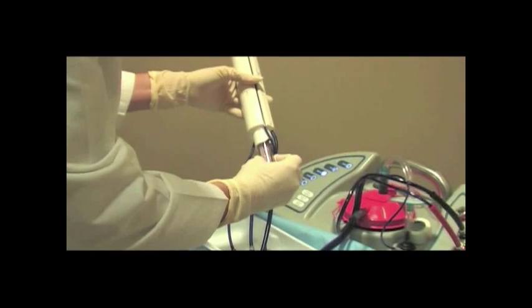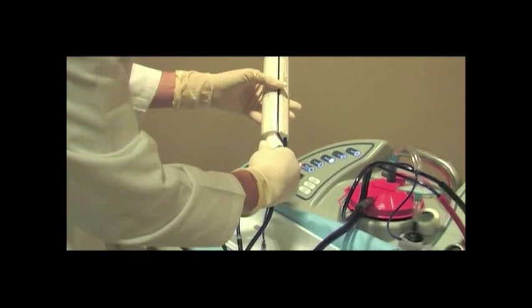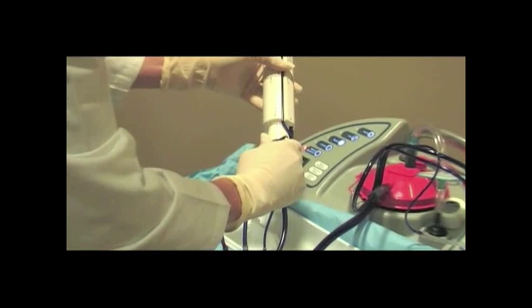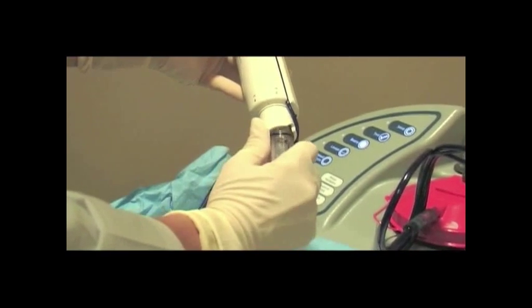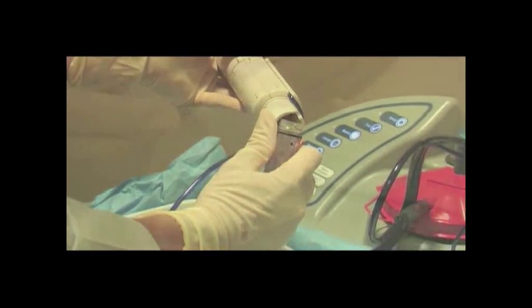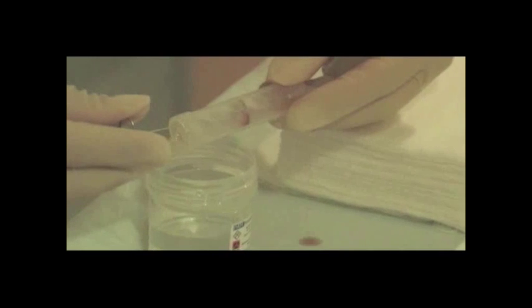The cores can now be retrieved from the filter chamber at the back of the handpiece. Place one hand on the handpiece and the other on the filter chamber and rotate the filter chamber counterclockwise to disengage from the handpiece. Grasp the thin metal wire spatula in the tissue filter. Before pulling up on the wire, tilt the tissue filter basket toward the specimen collection dish.